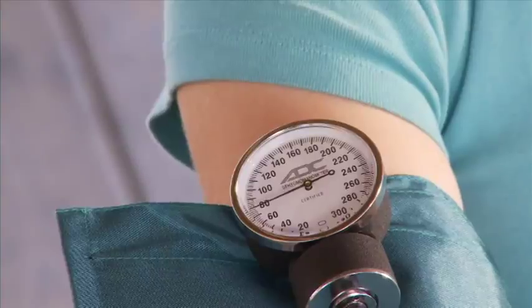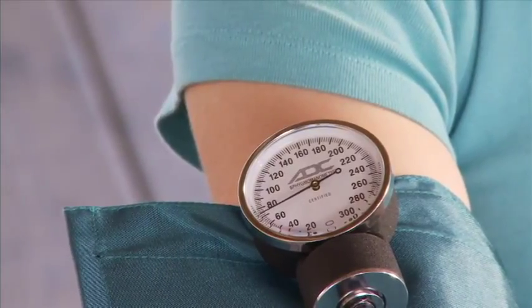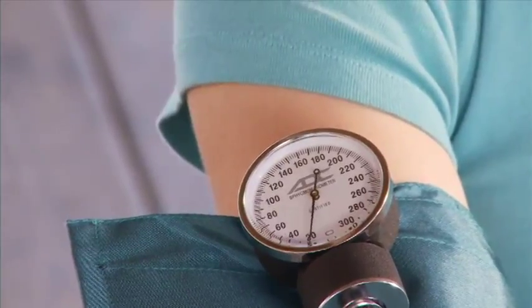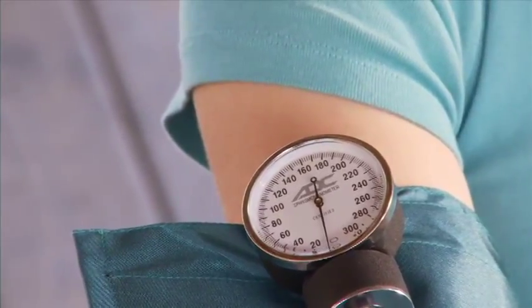With children and some adults, you may hear sounds all the way to zero. In those cases, record the pressure when the sound changes from a clear tapping to a soft, muffled tapping.